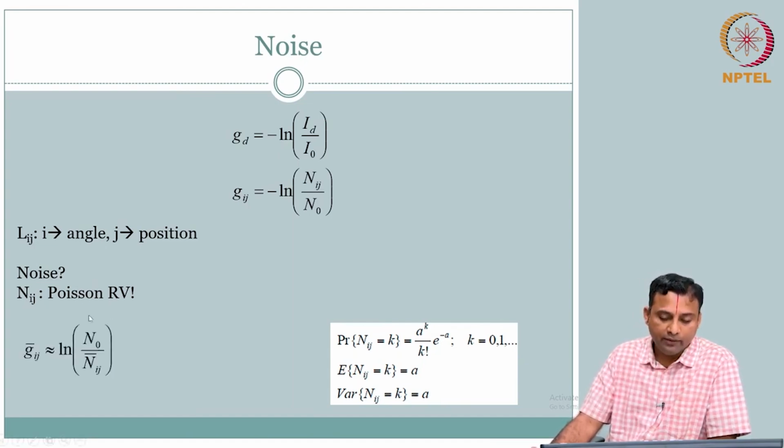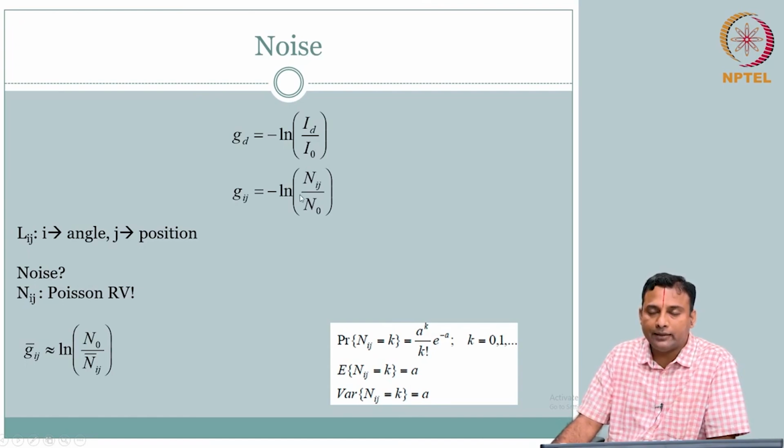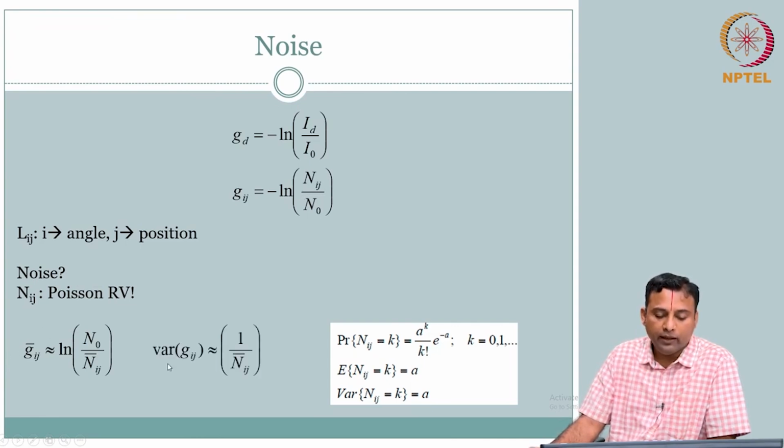So in our case, we can then say the randomness or the noise from n gets translated to the measurement noise, and therefore you have a mean of the measurement and a variance of the measurement, just because of your n. This is the random variable. So you have your mean and variance.